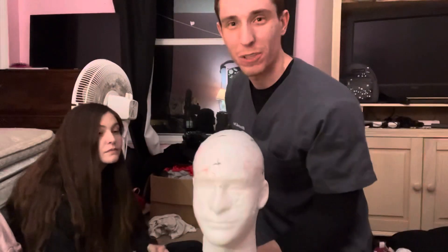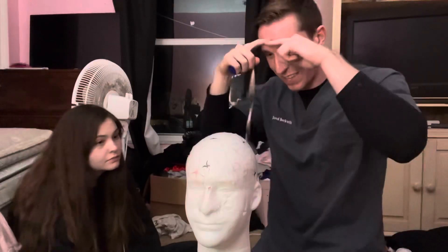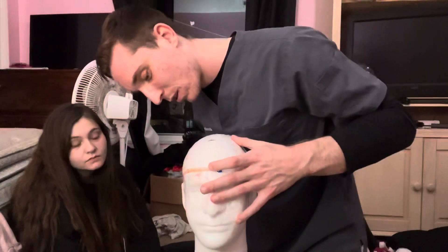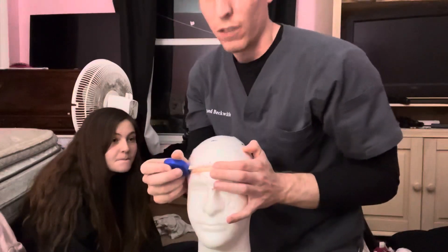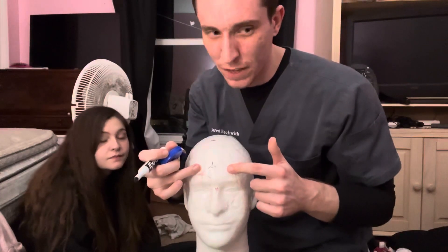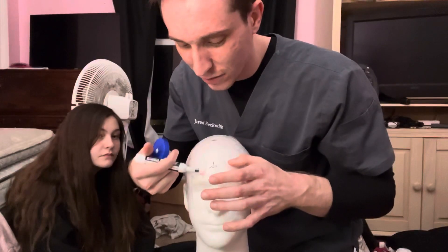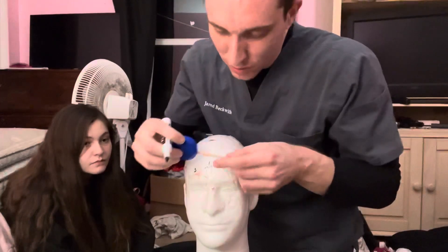Once you have front to back and side to side, then you're going to want to do the circumference, or as I like to call it, the headband. So just around the head, you're going to want to start from your FPZ mark, going through the marks you made previously, going all around the head, and we're going to get 55 centimeters. If you have 55 centimeters, one thing I like to do is mark FP1 and FP2. The distance between these two should be 5.5 centimeters, or 10%. So I use 5%, which would be 2.75 — usually around 3. So if it's 55 for the full thing, it's going to be 2.75 on each side.